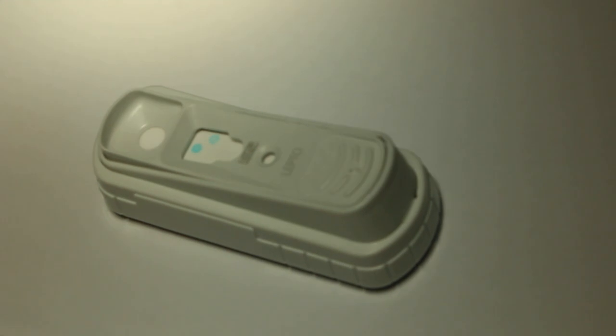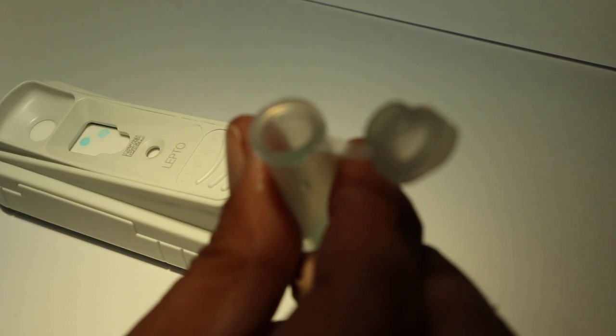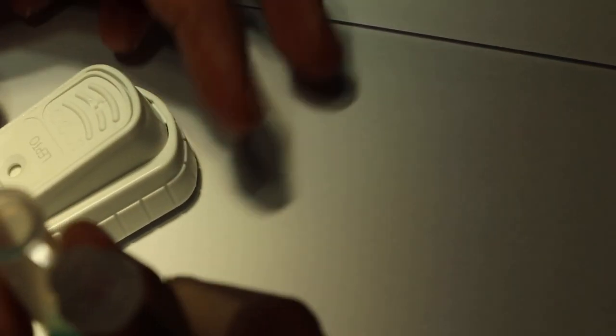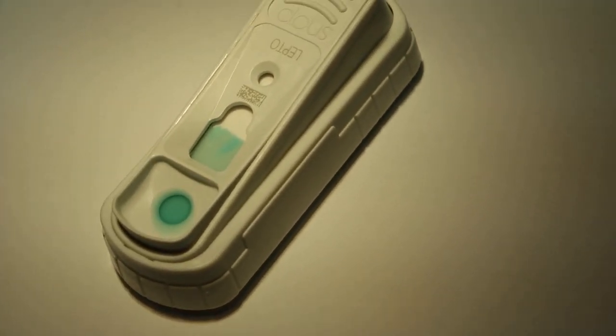Mix three to five times. Place the device on a horizontal surface. Add the entire contents of the sample tube to the sample well — be careful not to spill it. Your hand should be on the side so as not to block the video.